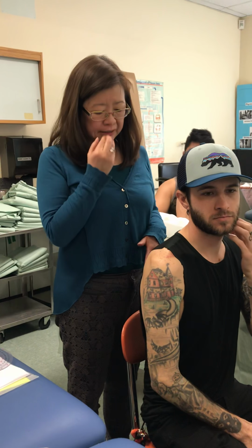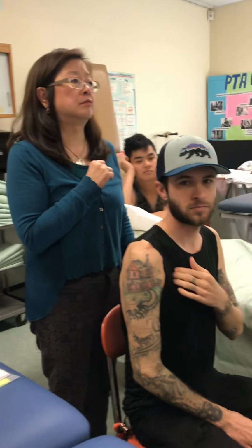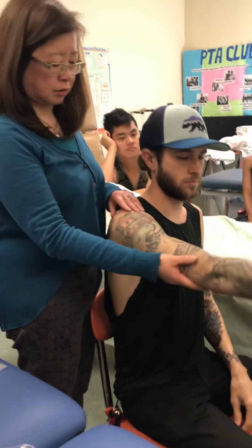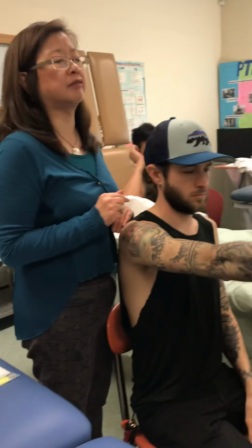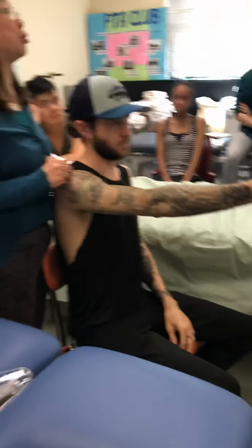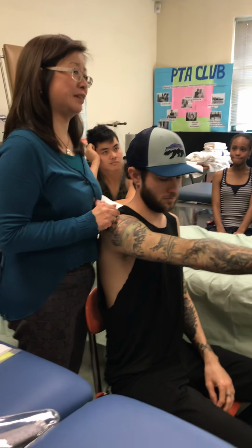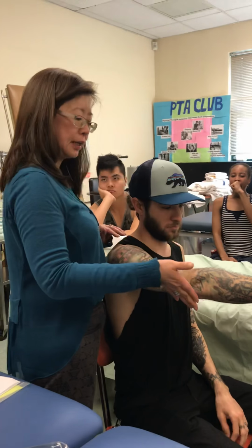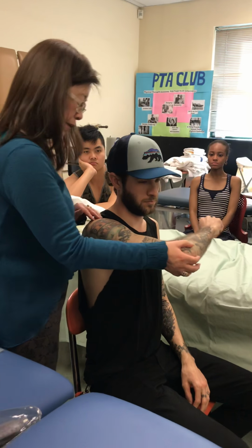So what is the definition of horizontal AB or AD? They have to start at what? How many degrees of what? 90 degrees of shoulder flexion. So, one given thing already. If he doesn't have 90 degrees of regular shoulder flexion, I'm not going to be able to measure horizontal AB or adduction. Yes or no? Okay? Alrighty. So to shorten the lever arm a little bit, I'm going to ask him to bend his elbow. And keep it like that.